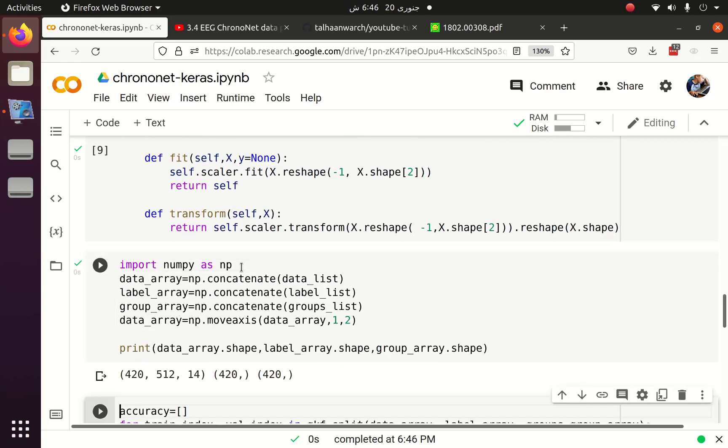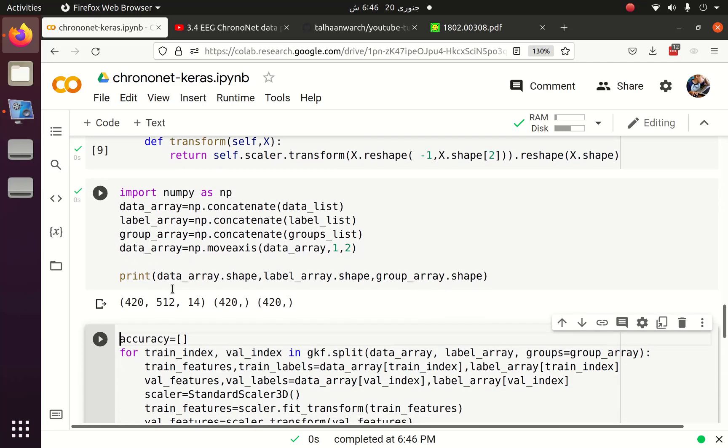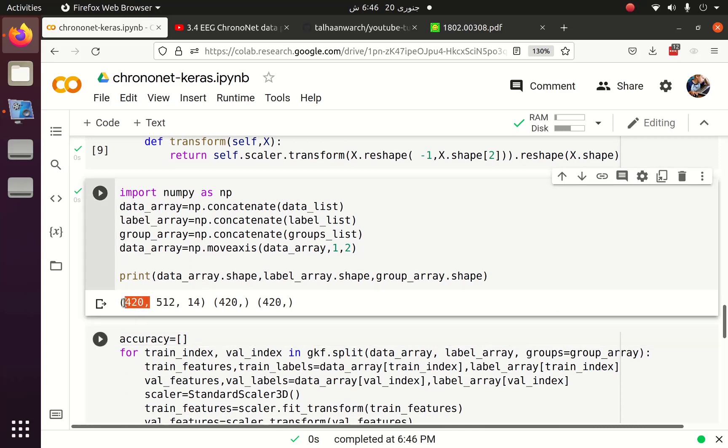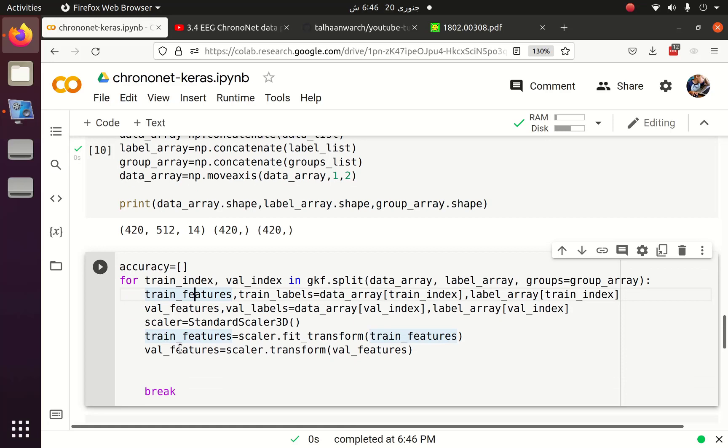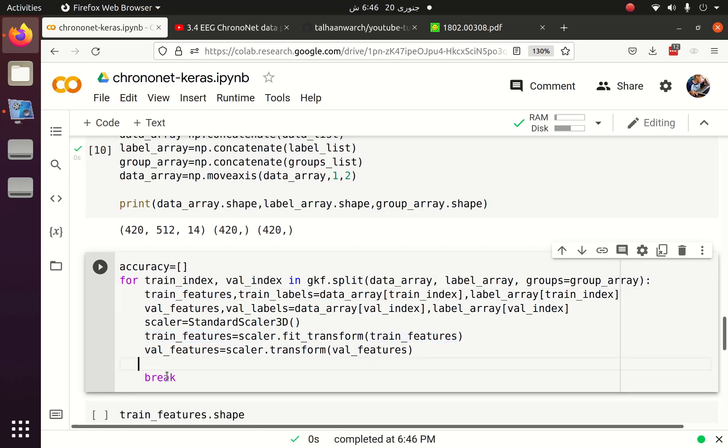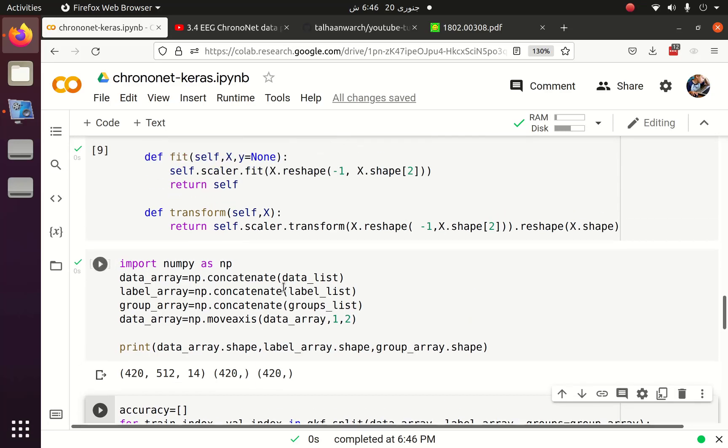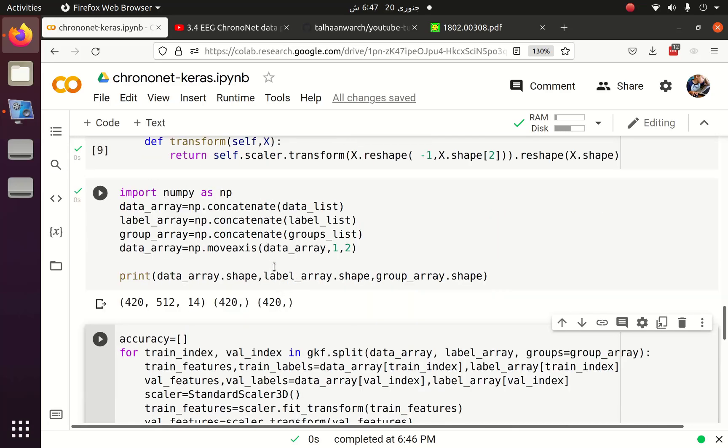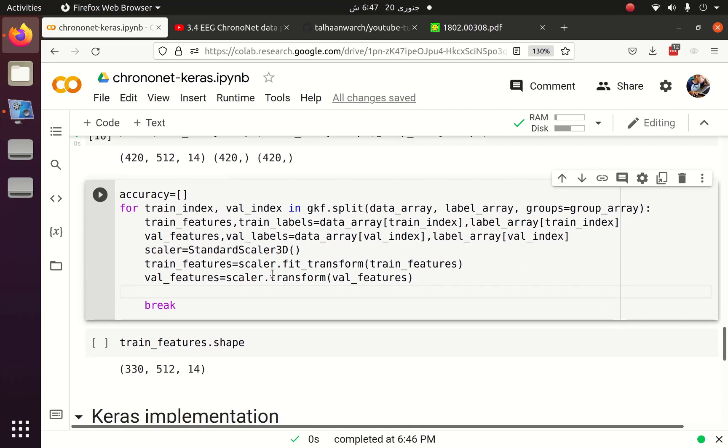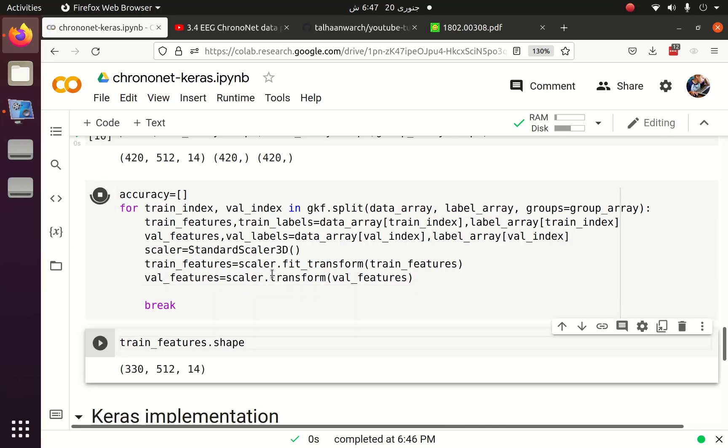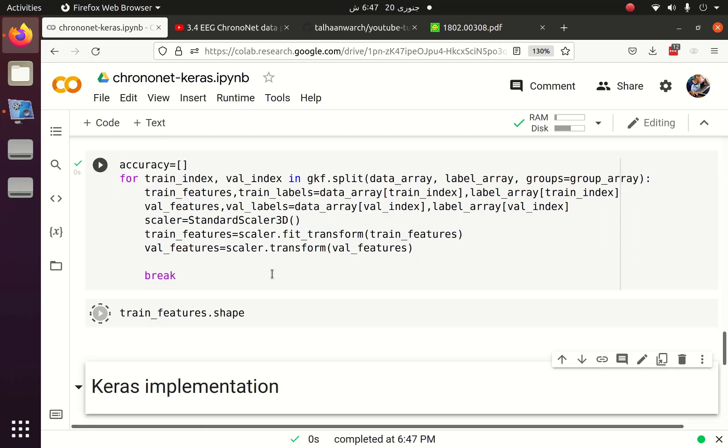I converted the list into NumPy array and now we have 420, 512, 14. 420 is the number of epochs or trials, 512 is the sequence length and 14 is the number of channels. Once we got the data in NumPy format we can split the data into train and validation dataset. For that we are going to use group kfold. I have also discussed in previous part why we have to use group kfold and why we can't randomly split the data using train test split.